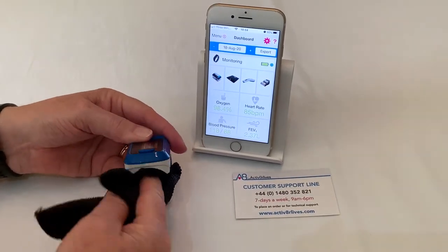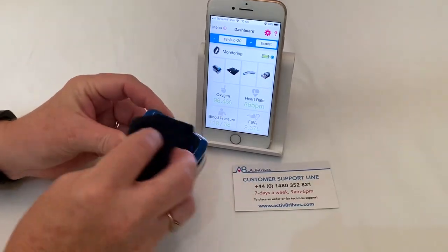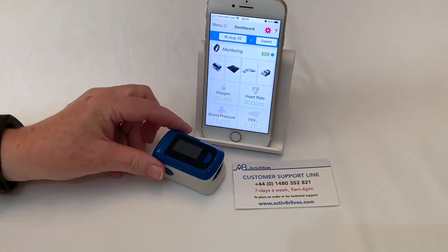You can clean the inside of the pulse oximeter with a microfiber cloth, and the outside as well. Don't use any wet wipes.